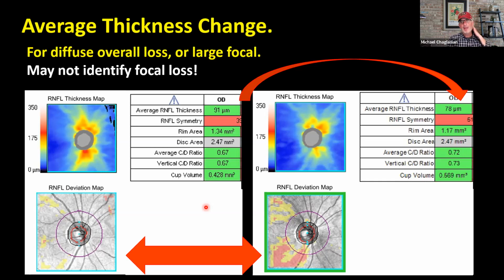Changing the baseline, in long-term patients, 10 years or so, who undergo a trabeculectomy, a tube shunt, or other significant changes, that's when I look towards changing the baseline. Or with the Zeiss instrument, I can actually do dual baselines.